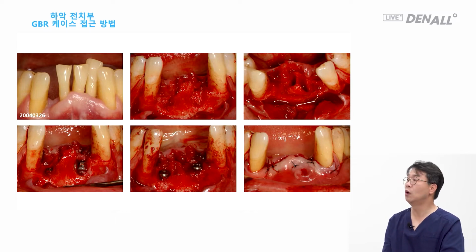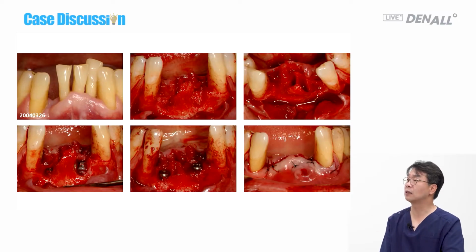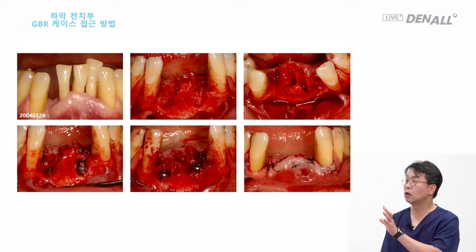As I said last time, I prefer to use autogenous bones. So here, autogenous bone is available. And I try to level the implant placement positions as much as possible. Some need to be placed deeper. So I try to build the area so that implants can be placed in similar positions. In the middle of 42, there's a lot of bone loss. The vertical bone height increasing GBR can be chosen, but at number 43, gingival recession is observed. Even though the bone height can be aligned with the GBR, it has a higher probability of a recession later.